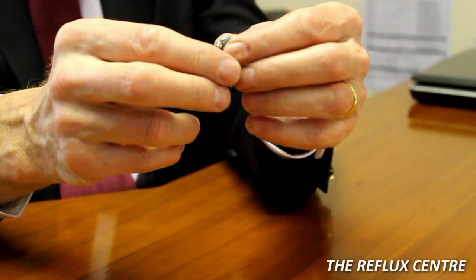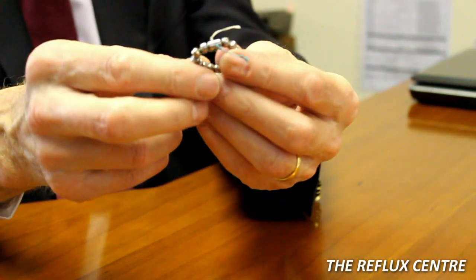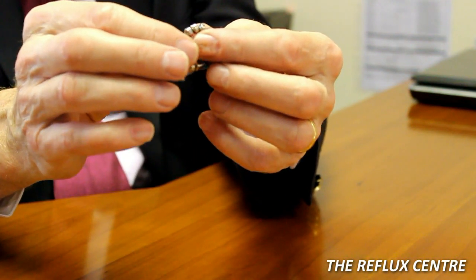That essentially is how the device fits around the lower part of the esophagus. The Lynx device, as you can see, is a series of titanium beads. Inside each of these beads is a neodymium iron boron magnet — a rare earth magnet that doesn't lose its magnetism. These beads are attracted to each other, and it is simply the magnetic force between these beads which keeps this lower esophageal sphincter closed. It's just as simple and as elegant as that.